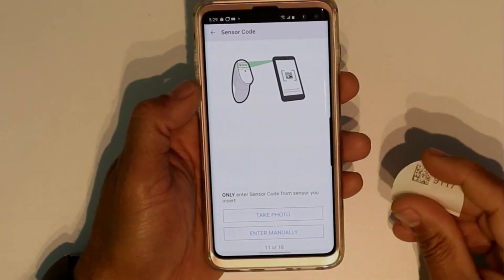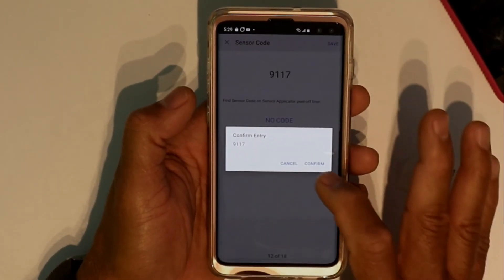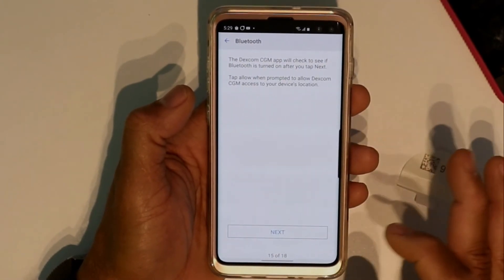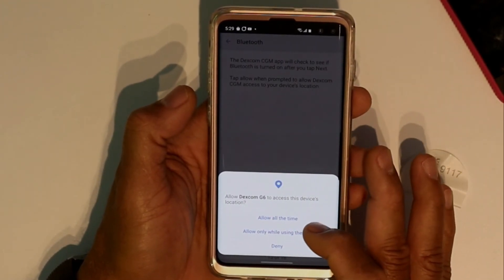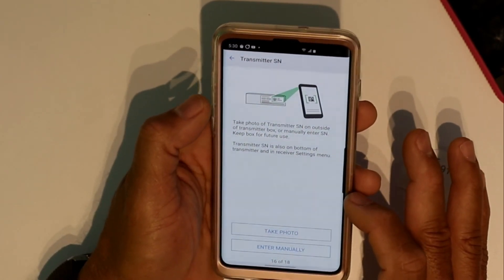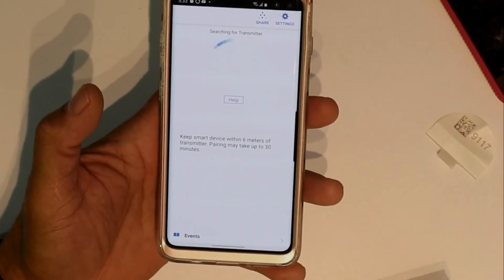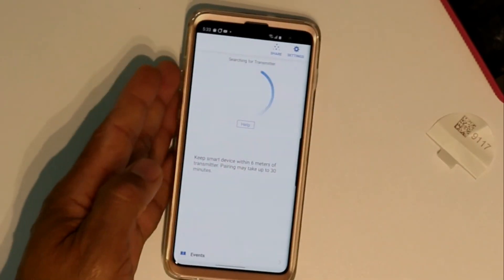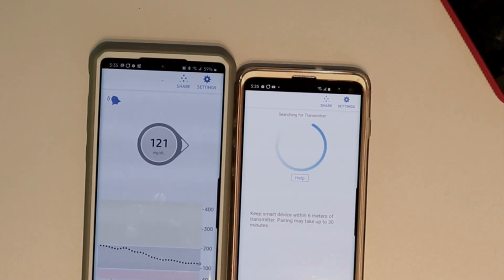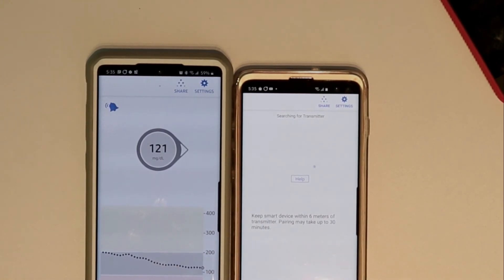You're going to have to enter the sensor code — the same way you would enter it on your receiver — manually, then confirm. Make sure Bluetooth is on and allow the app to access your device. It's going to ask for your transmitter number — enter it manually. It will start searching for your transmitter; it may take up to 30 minutes, but most times it goes faster. That's how you get the Dexcom G6 app running on newer Android devices with the latest Android versions.